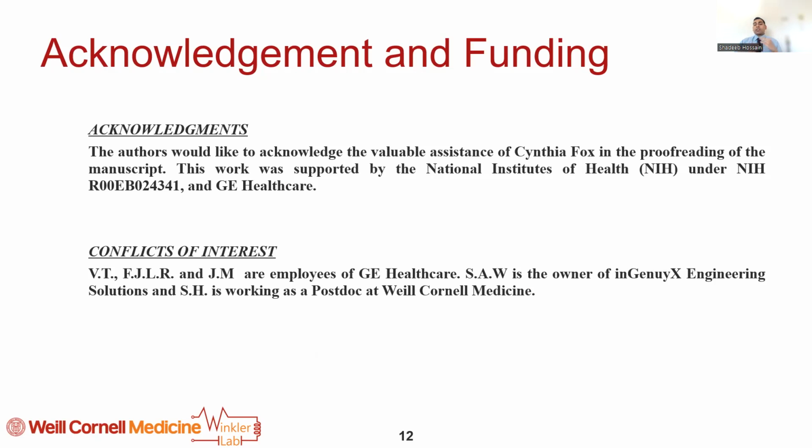But to summarize, we actually tried to develop a 2D cylindrical high pass ladder, which is an RF coil for 7 Tesla. We realized when each of these resonating elements is tuned at 286 megahertz, only then are you able to reach the eigenfrequency of 298 Larmor frequency, which is required for our 7 Tesla. The capacitors we used were 12 picofarad capacitors at the four ends, followed by a variable capacitor so that you can tune it at different frequencies.